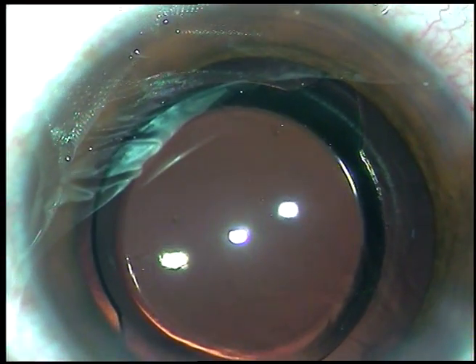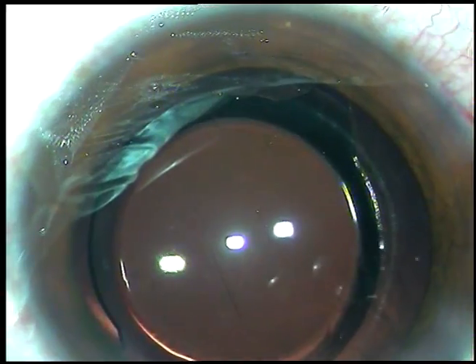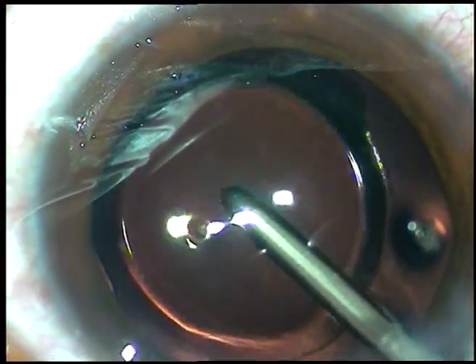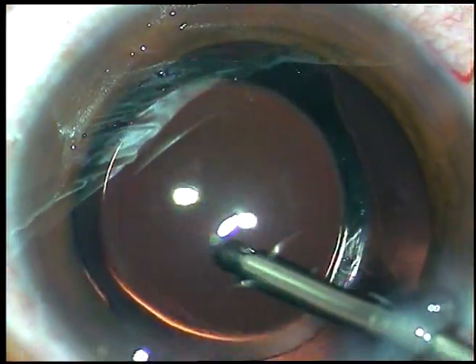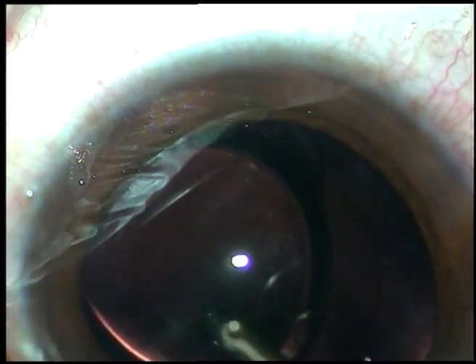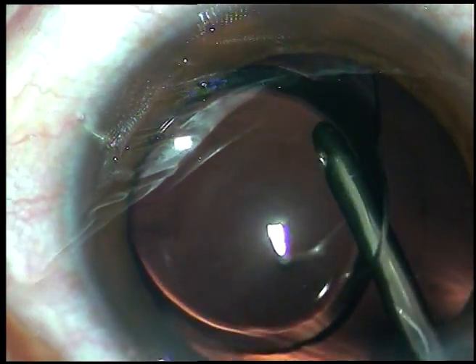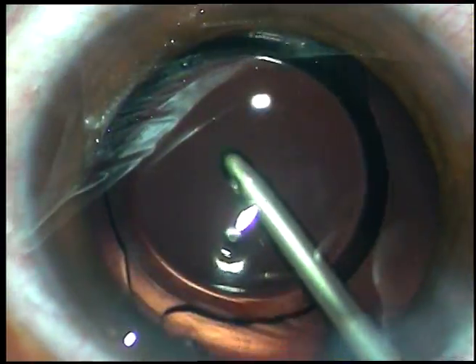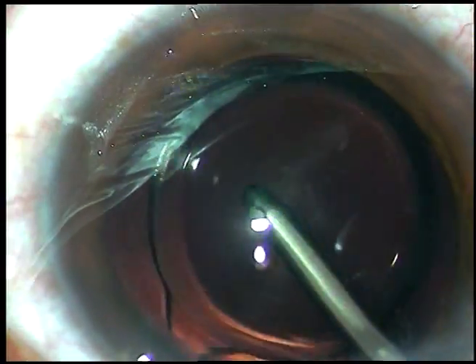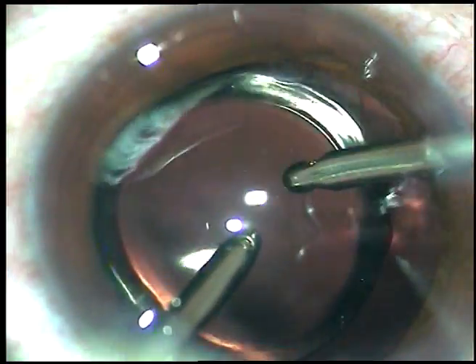First, I use the Simcoe and irrigate and aspirate for some time. Then I use the irrigating probe of bimanual IA to irrigate the anterior chamber. Then I go behind the IOL and irrigate the capsular bag very nicely so all the viscoelastic substance in the capsular bag comes out. This prevents rise of intraocular pressure in the postoperative period — it is very important to remove all the viscoelastic substance.